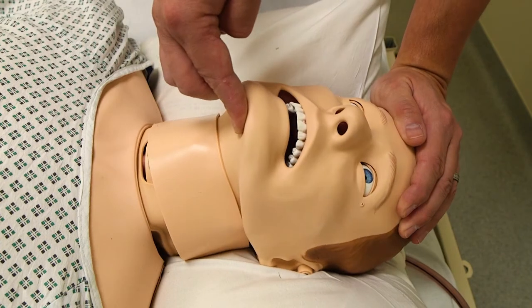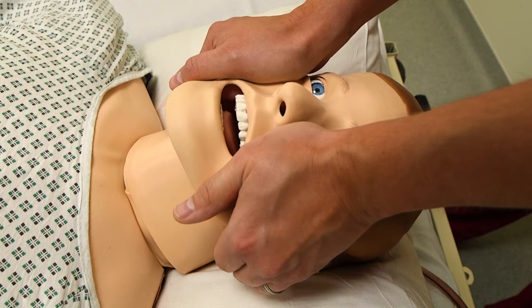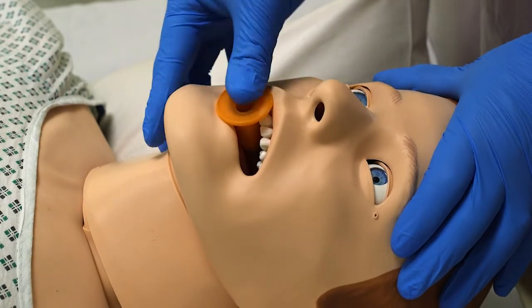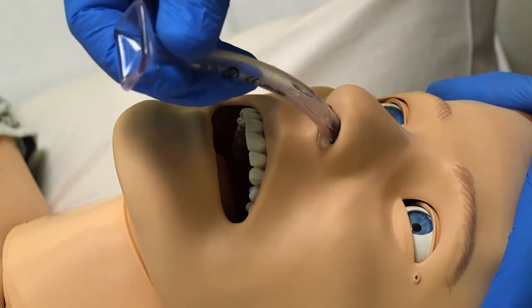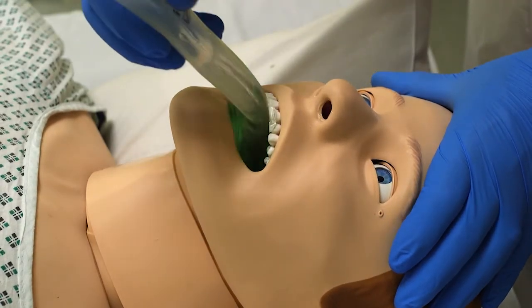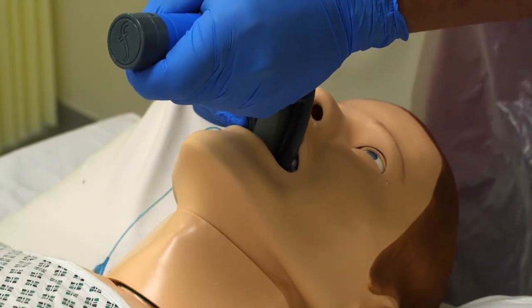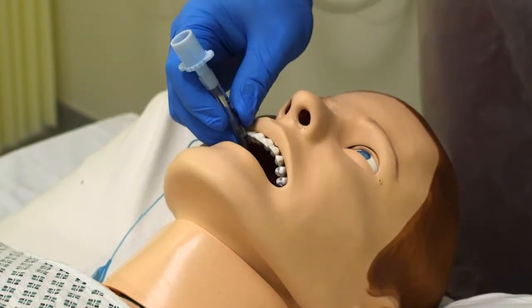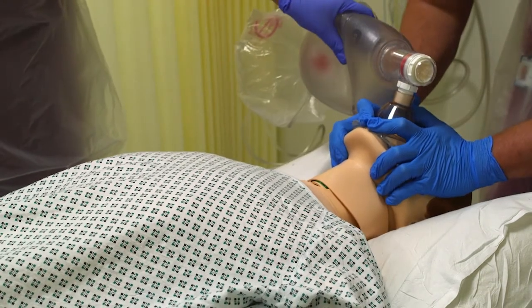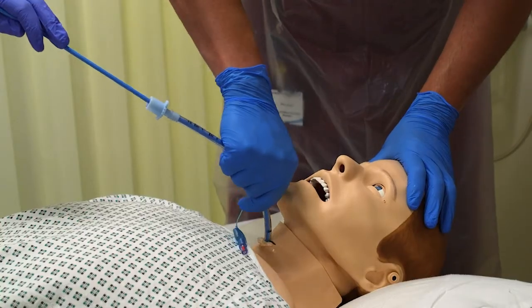Head tilt chin lift, jaw thrust, oropharyngeal airway, nasopharyngeal airway, laryngeal mask airway or I-gel, intubation, bag valve mask ventilation, front of neck access.